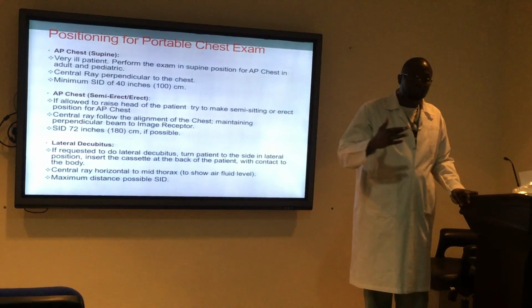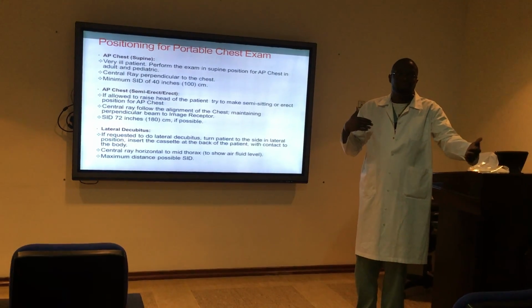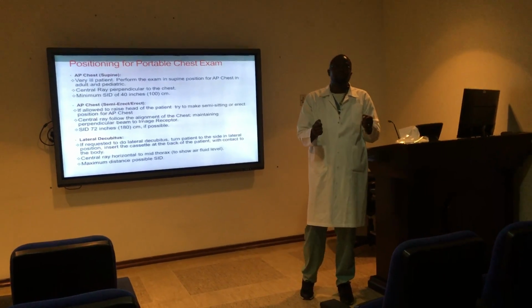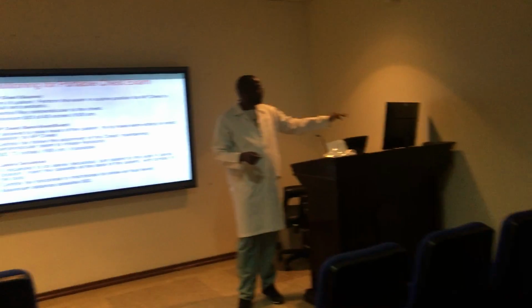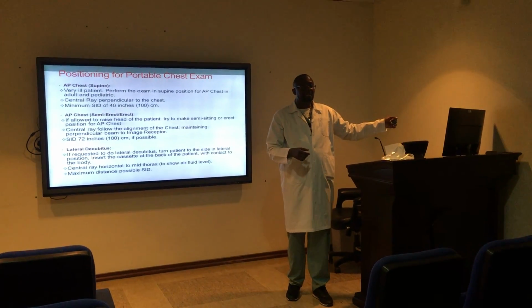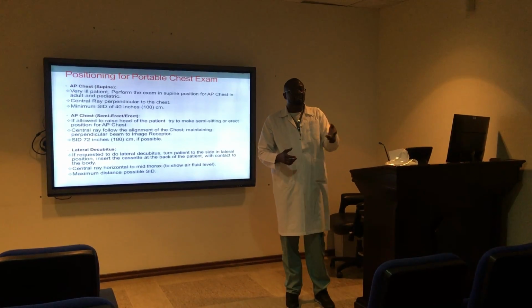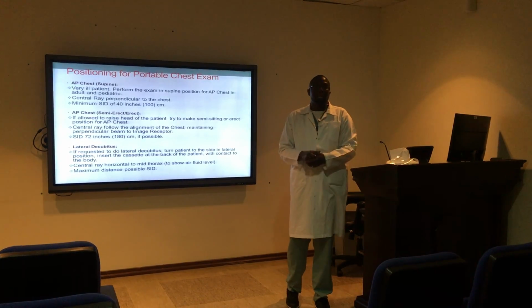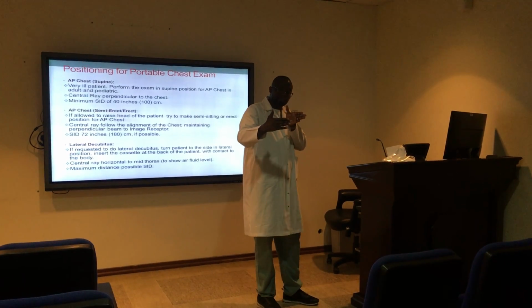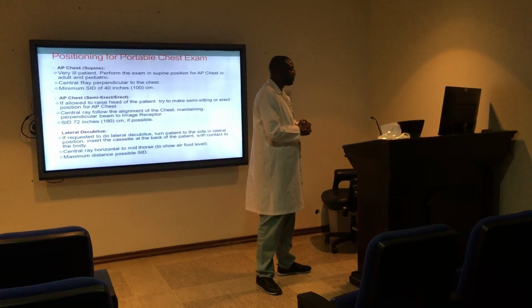Here, you just try to be as far as possible. There are a few different schools of thought here. I just try to keep the maximum you can do for a chest X-ray. In many instances, you might not be able to achieve the 180 centimeters due to the patient's room, okay? So, not too close, as far away as possible.